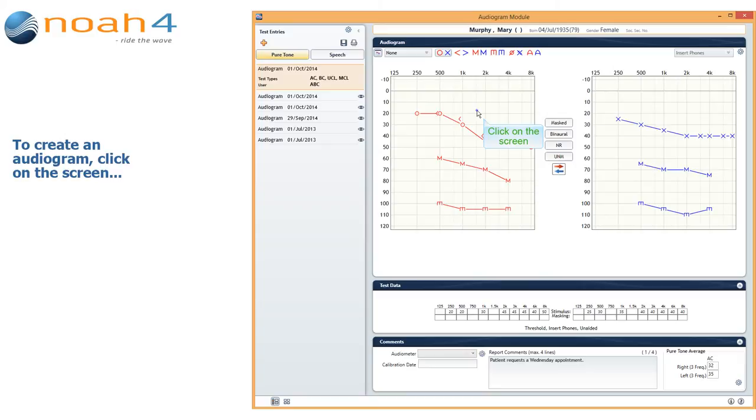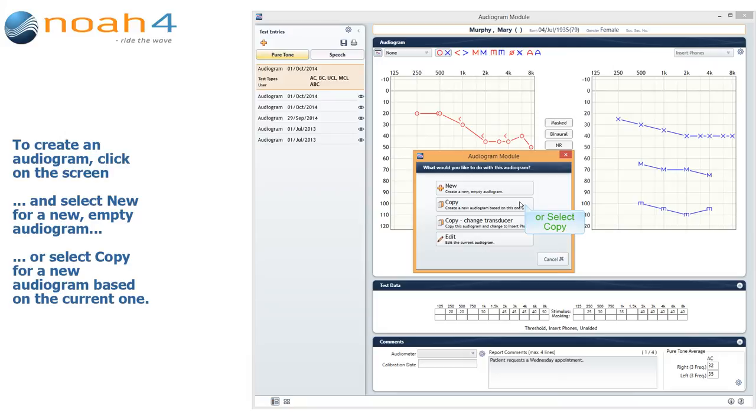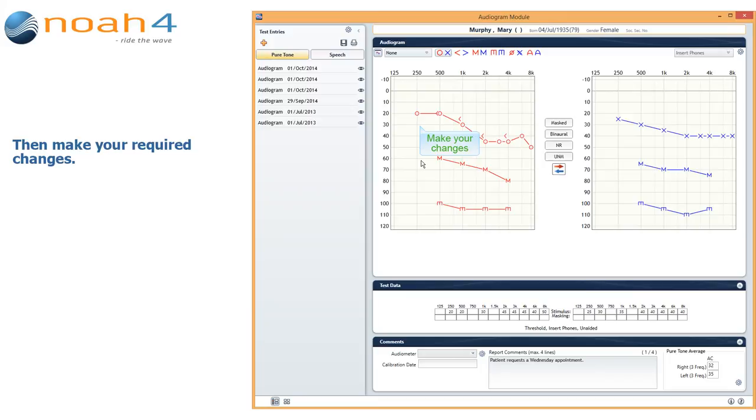To create an audiogram, simply click on the screen and select New for a new empty audiogram, or select Copy for a new audiogram based on the current one. Then make your required changes.